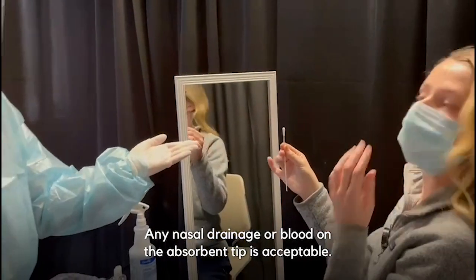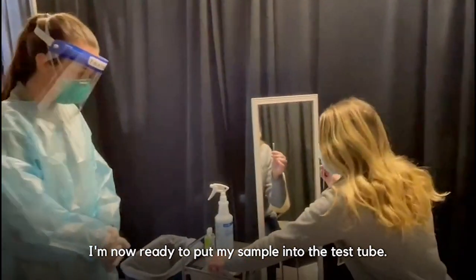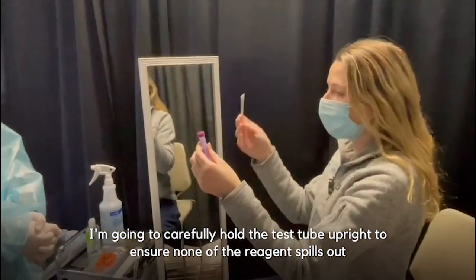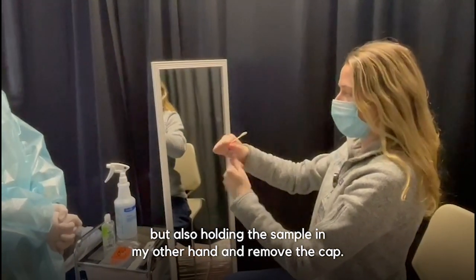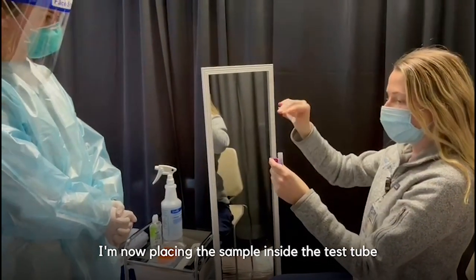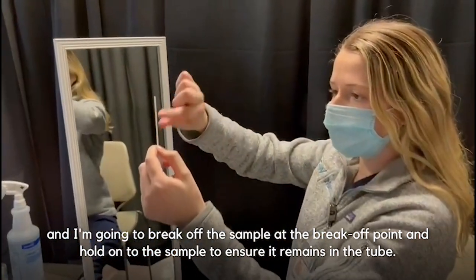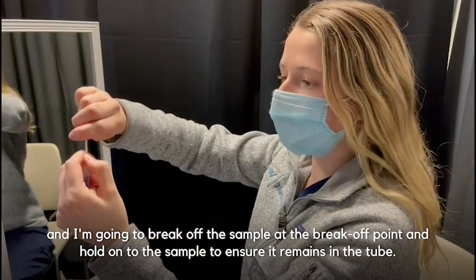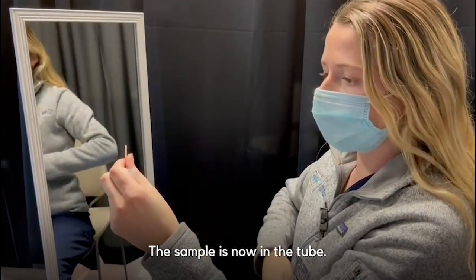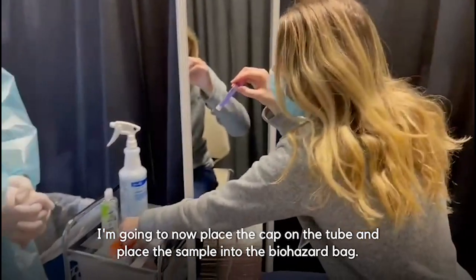Any nasal drainage or blood on the absorbent tip is acceptable. I'm now ready to put my sample into the test tube. I'm going to carefully hold the test tube upright to ensure none of the reagent spills out, holding the sample in my other hand and removing the cap. I'm now placing the sample inside the test tube, and I'm going to break off the sample at the break-off point and hold onto it to ensure it remains in the tube. The sample is now in the tube.